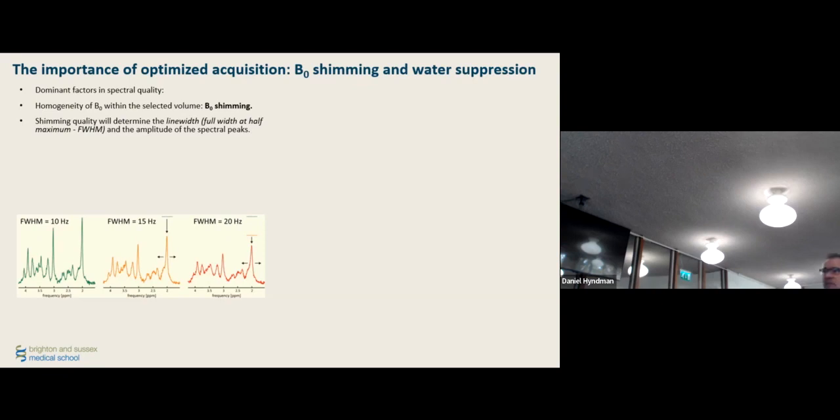And indeed, the spectral lines that are associated with the spectral acquisition at a very well-shimmed magnetic field and a not so well-shimmed magnetic field, well, you can see the lines become broader, but the spectral content is the same, so something has to give. So the amplitude goes lower. If it goes lower, you will lose signal to noise ratio, you lose the signal.